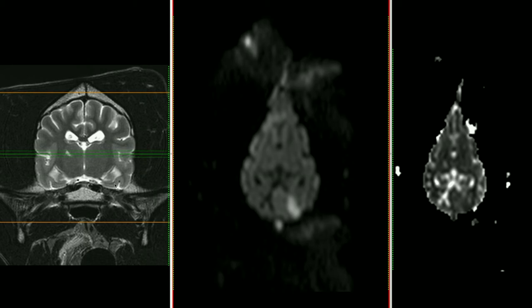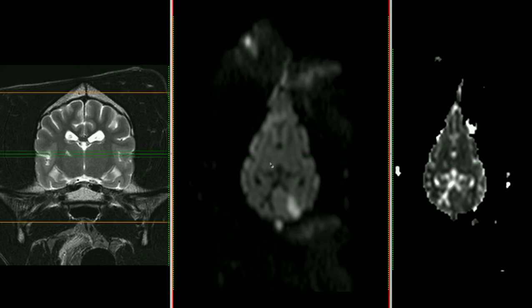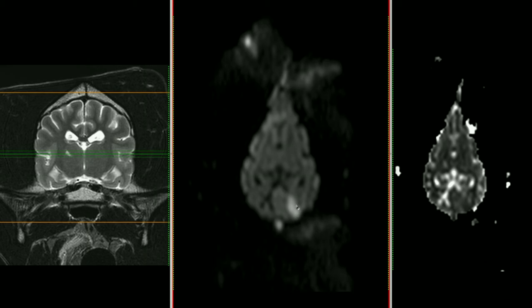Looking at the right thalamic lesion on diffusion weighted imaging, it is low signal on DWI and high signal on the ADC map, indicating increased diffusibility — similar characteristics to CSF. Likewise the lesion in the right cerebellar hemisphere also shows high diffusibility, similar to CSF. However, the lesion in the left cerebellar hemisphere shows the pattern of restricted diffusion: high signal on DWI and low signal on the ADC map, confirming restricted diffusion. In stroke imaging, restricted diffusion is typically seen in the acute stages and is consistent with an acute ischemic stroke.